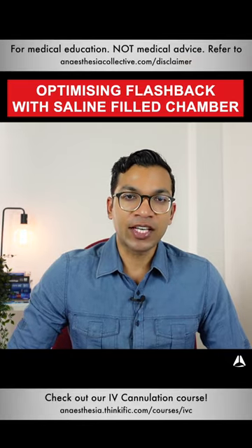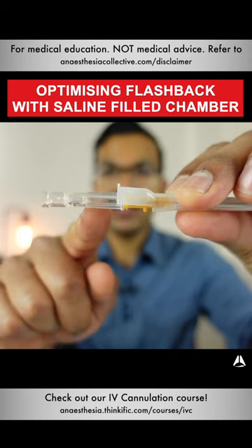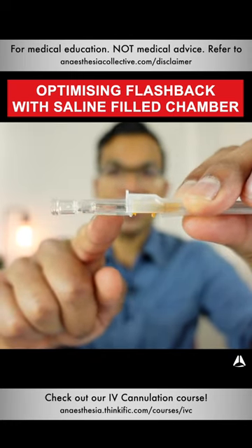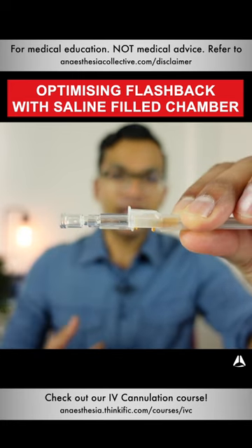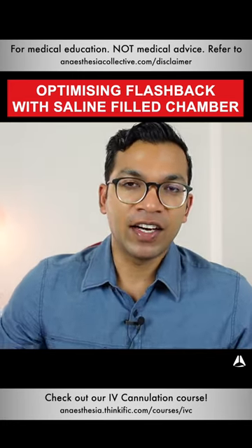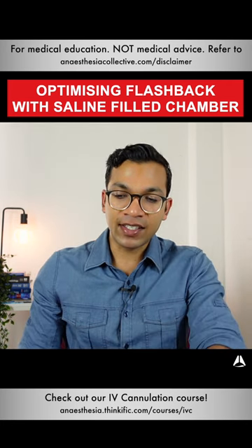Why would you want to put saline in your cannula chamber? Here we have the chamber of the cannula, and we're going to fill that with saline. That's going to speed up the process of flashback, and that's really important. Flashback is absolutely vital — it's the first indication, the only indication, that your needle is actually inside the vein.